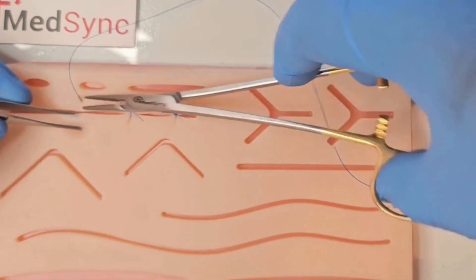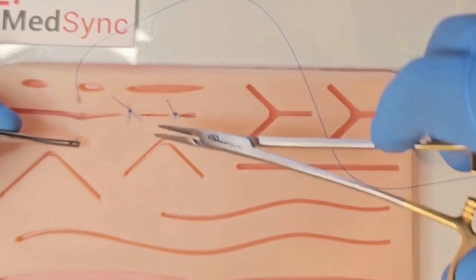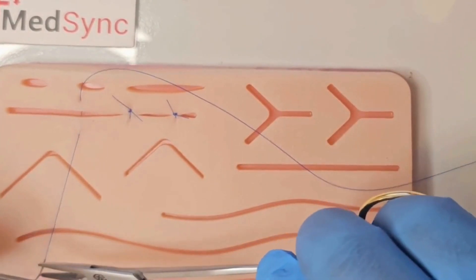Enter at 90 degrees. Pull the suture through. Lay the needle holder between the long and the short ends of suture.